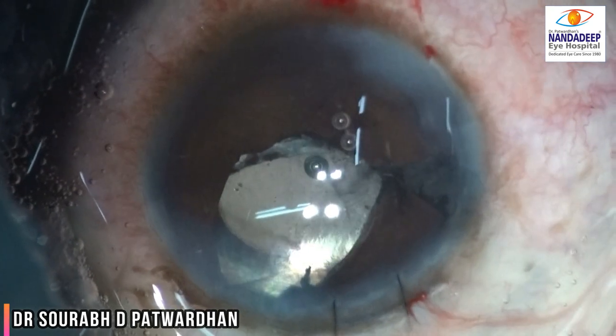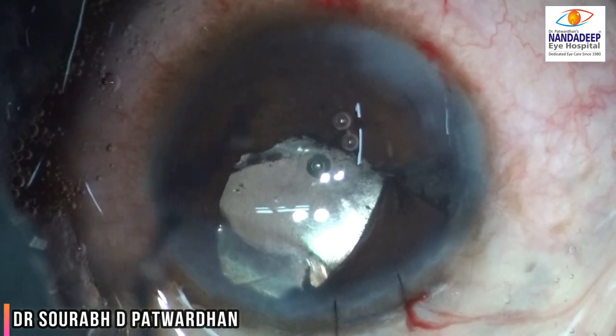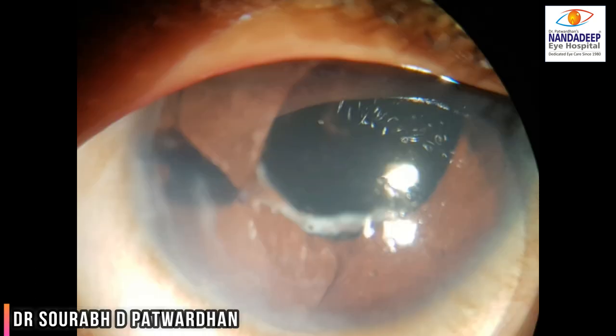If required, we can also do a peripheral iridectomy, but in this case there was adequate iris defect present nasally, so I did not do a PI. This was the end of the procedure. You can see I have reduced the iris defect quite significantly and placed the IOL. The patient did really well with an aided vision of 6/12. Thank you.